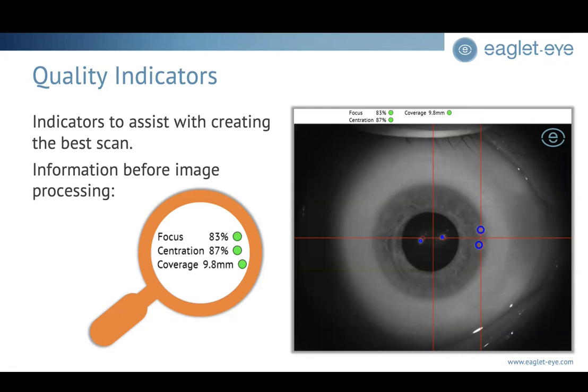The other thing that we're really cognizant of in the clinic for high quality acquisition is to get the lids out of the way enough that we have enough real estate. So that involves taking the eyelids and pulling straight up, not to the side, and straight down, not to the side, because that will allow for a nice even opening.